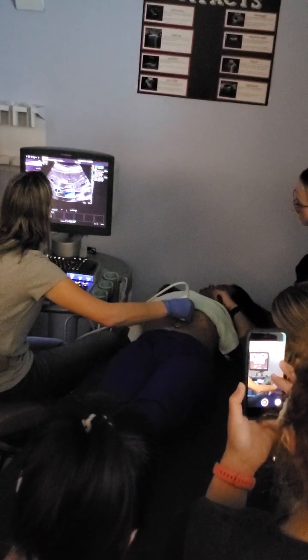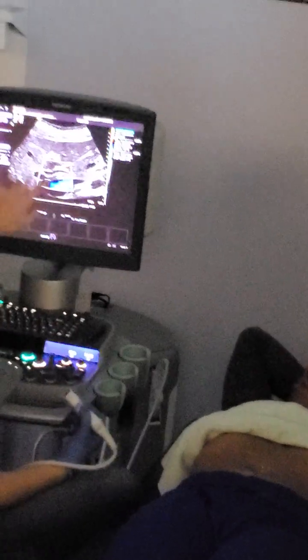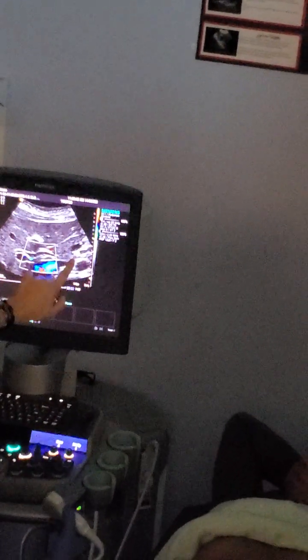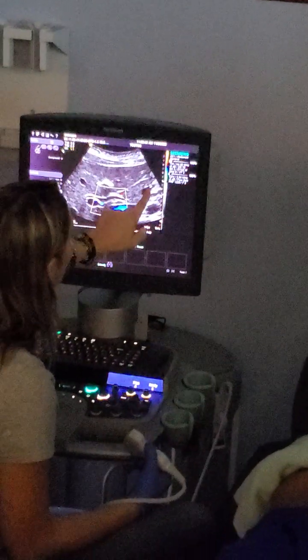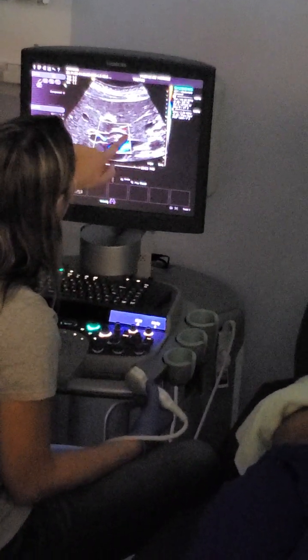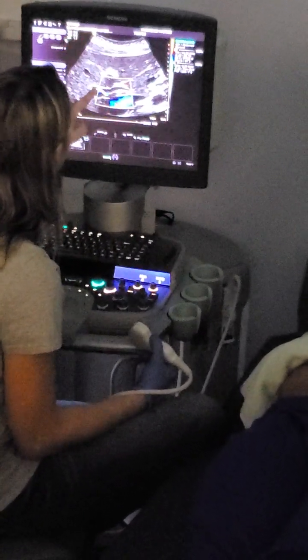Oh, look at that, by the way. Even better. So we've got it. So here's where it's coming into. So here's pancreas right in here. So uncinate, a little bit of the head. This is oblique, portal splenic confluence obliquely. And so we've got where this is coming into that posterior aspect of the pancreatic head. We're able to trace it all the way to the common hepatic duct.